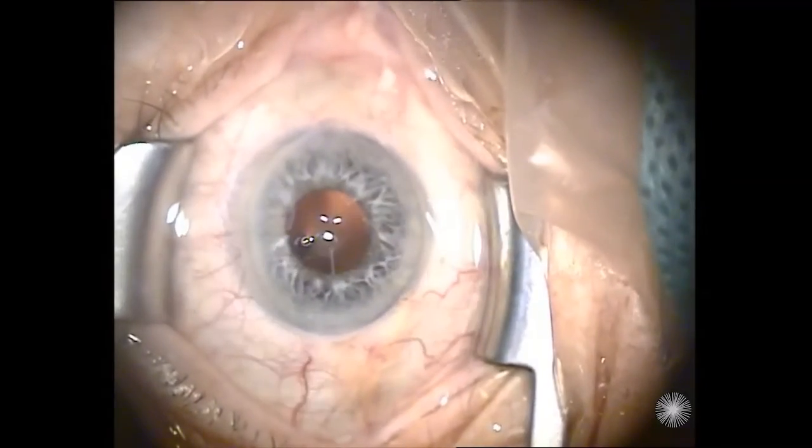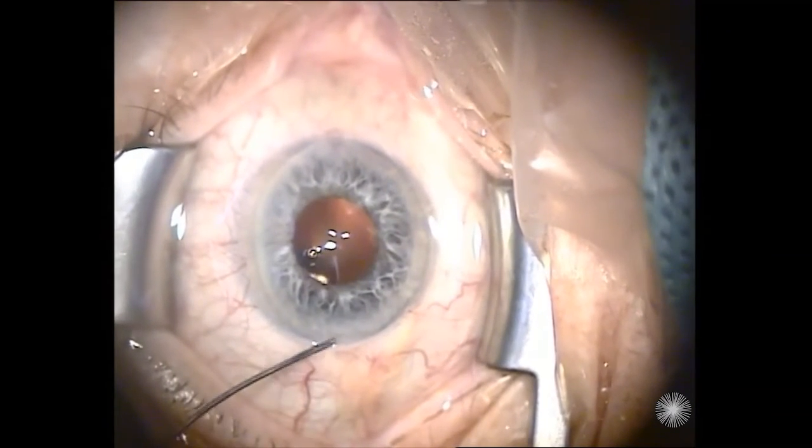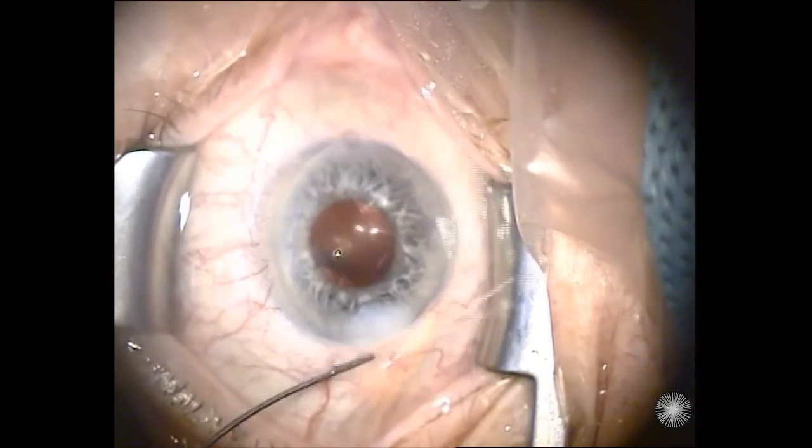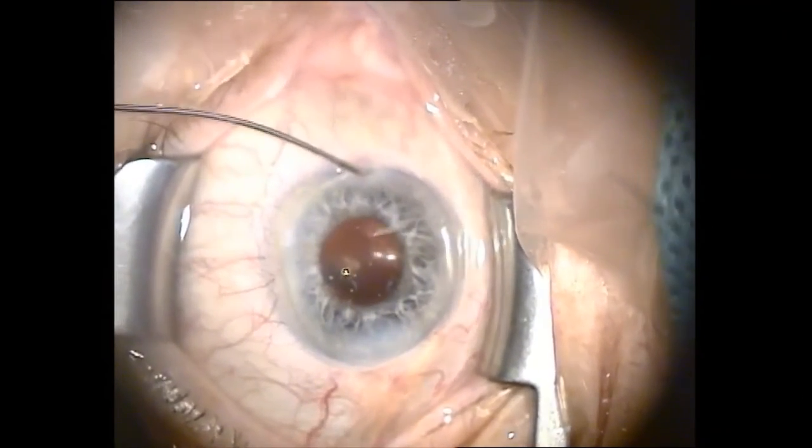It's very important to get a high intraocular pressure at the end of the surgery. Otherwise, the hyphema would not be unexpected in this situation. We seal the side ports with hydration once more with BSS.